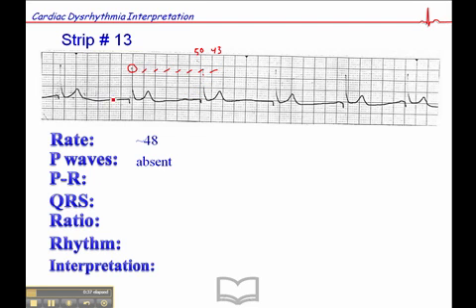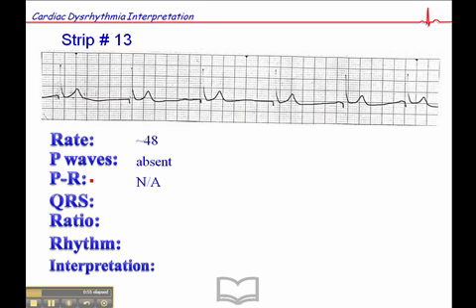P waves are absent — we don't see P waves anywhere. There's a wavy baseline, but no P waves. You might look at it and wonder about that, but it's nothing, don't get excited — it's probably just artifact. There are no clearly discernible P waves.